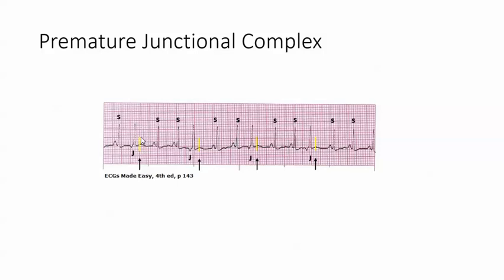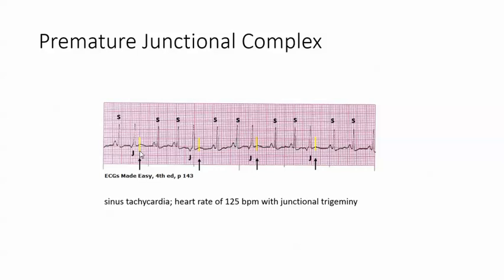So this is a premature junctional complex. The way that we're going to report this is sinus tachycardia with a heart rate of 125 beats per minute with junctional trigeminy. Trigeminy is when this premature complex happens every third beat, and that's exactly what's going on. You have two sinus beats, a junctional, two sinus, junctional, two sinus, junctional. So this is trigeminy.